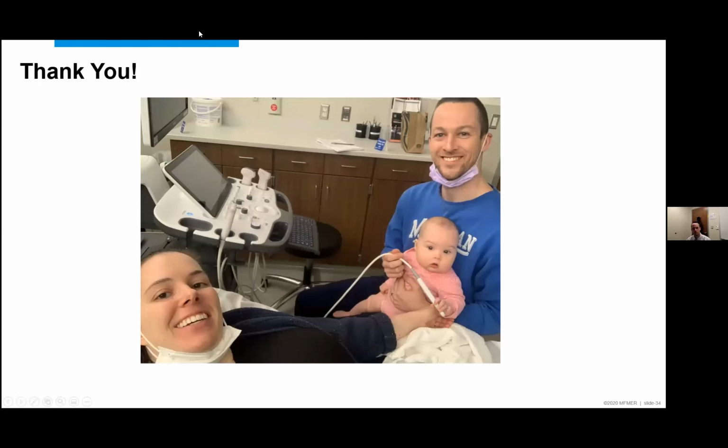All right, great job, Dave. Yeah, that was perfect. That is exactly what we want from these cases. Great overview of a protocolized scan of this area, and the dorsal wrist is a busy area, right, with a lot of structures and a lot of stuff going on. I thought you did a great job going over everything, and as expected, your images were great as well. So kudos to you.